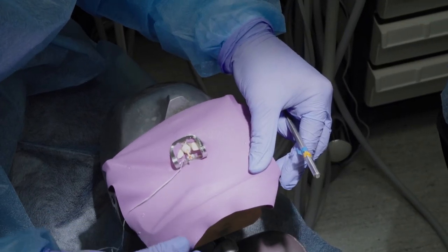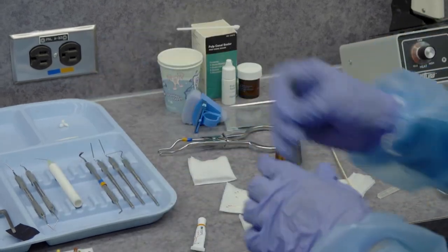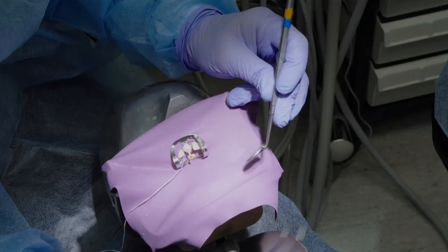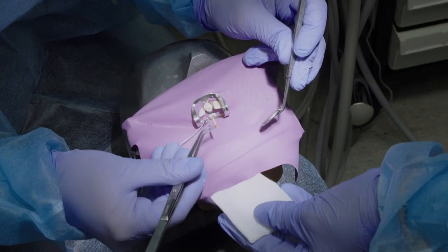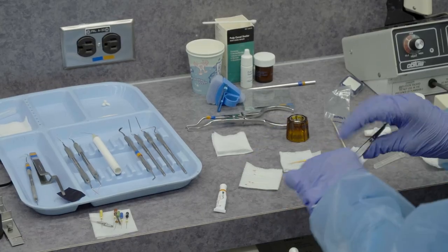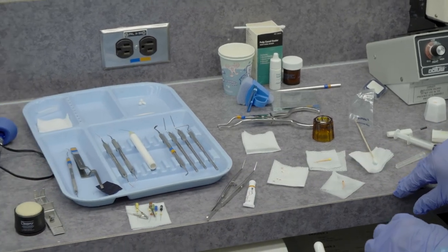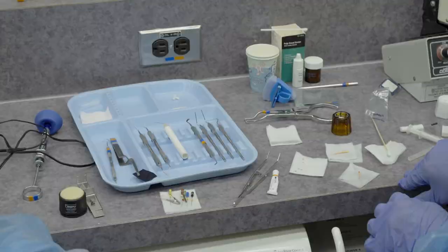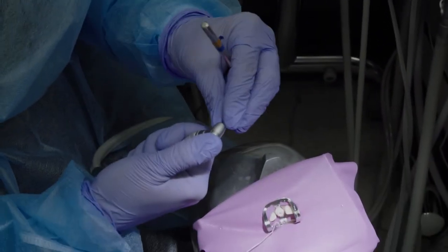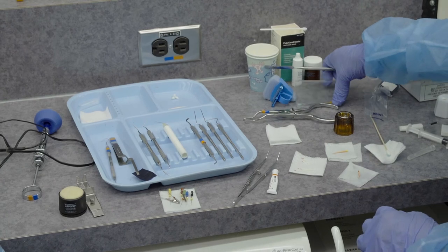The image confirms the length of the guttapercha, so the assistant will pass back the locking pliers to retrieve the guttapercha. We are now ready to cement with the endodontic sealer the guttapercha. So the dentist will place the lentulo spiral into the slow speed handpiece while the assistant mixes the endodontic cement sealer.